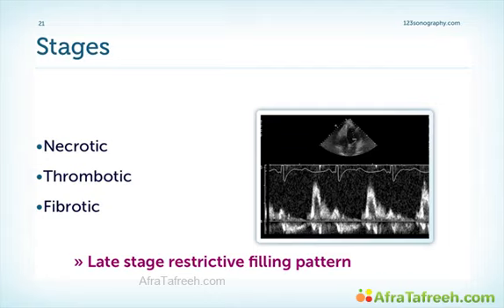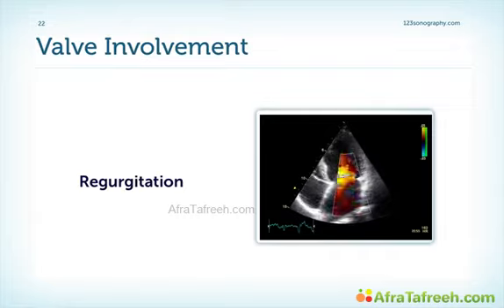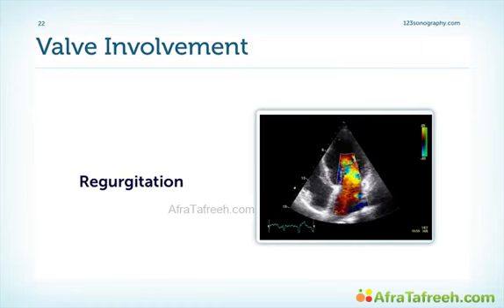So as you saw in this patient, and as I mentioned earlier in the presentation, patients with restrictive cardiomyopathy do not necessarily have to have a restrictive filling pattern. This patient only had pseudonormal pattern. So there are different stages which also are described as a necrotic stage, a thrombotic stage, and a fibrotic stage. And we know that a restrictive filling pattern is way at the end of the line of the disease. It's a late stage sign. Since fibrosis also involves the endocardium of the valves, you can expect to also find regurgitation in many patients. Sometimes regurgitation can be very severe. Usually in these cases you find a restrictive motion of the leaflets.